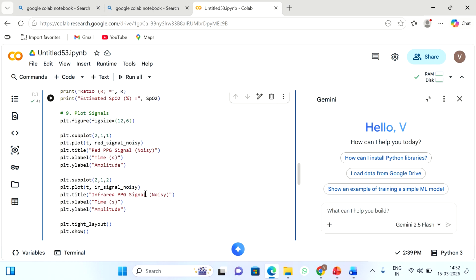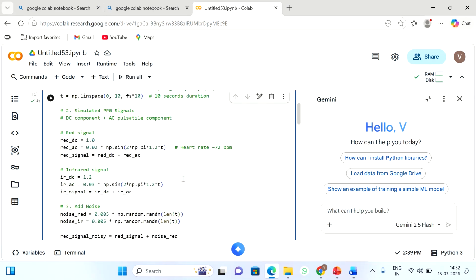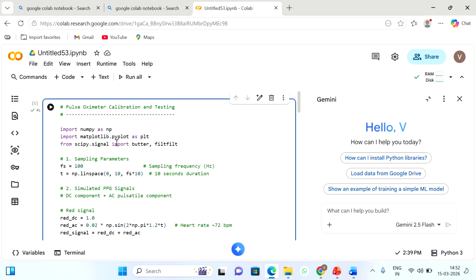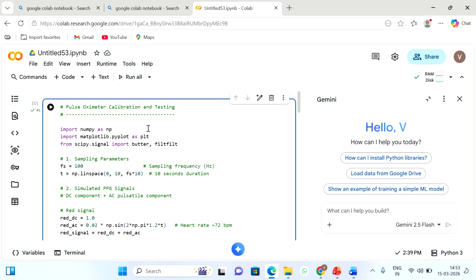So here, first we have to import the NumPy library, the NumPy Python library as np. And then we take matplotlib.pyplot as plt. Wherever we see plt, it is able to plot the output. pyplot is the module from which matplotlib is imported, and it is used to take the output in terms of a box plot or an ordinary graph of one parameter versus another parameter, and then a histogram. Like that, so many outputs we can draw.